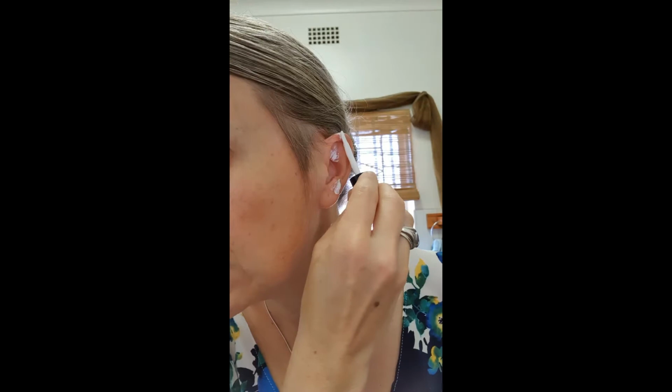And if I go back to the top, you can see that one is actually quite obvious again, just as the latex flows into it. So this, once again, is snow white, and you can see the one that is lifted. I now need to wait for it to dry, and it needs to get completely see-through. If I fiddle now with makeup on it, the makeup will set in the white and it will stay white.